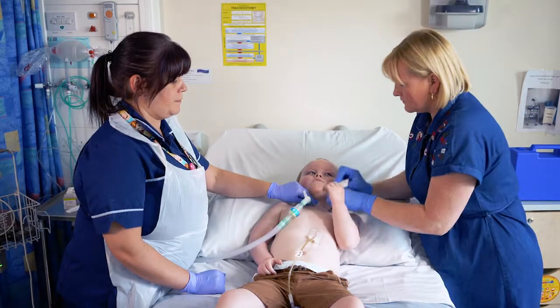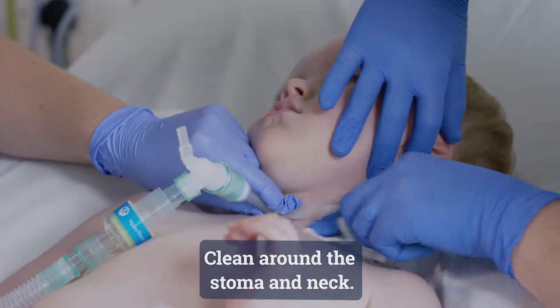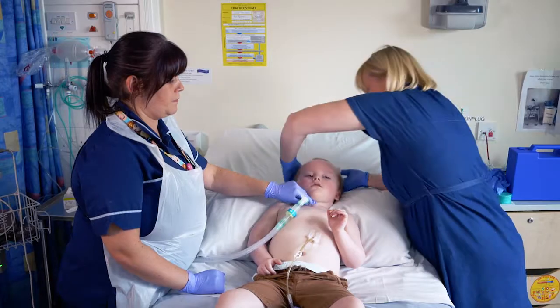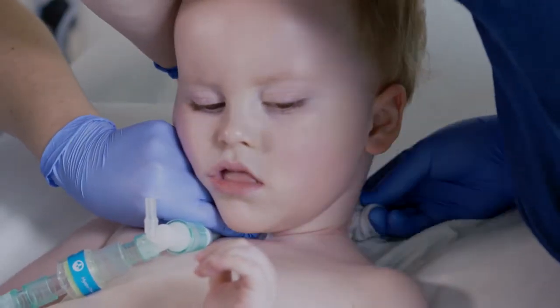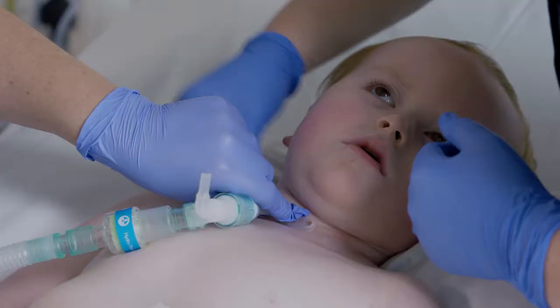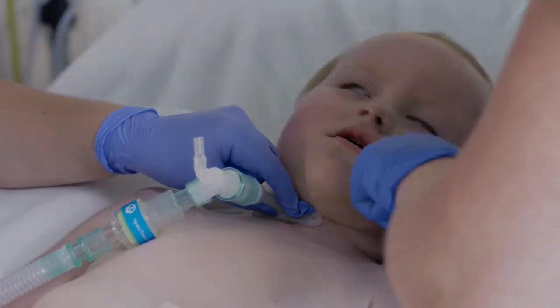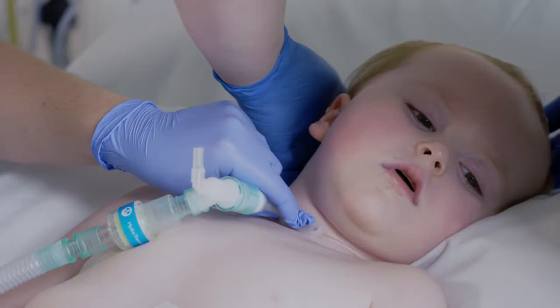I want to clean it. So let's clean it. Get under here. Let's just clean all the way around. It's nice and clean. Good boy. Let's turn it this way. Let's get right under there. Dry it.